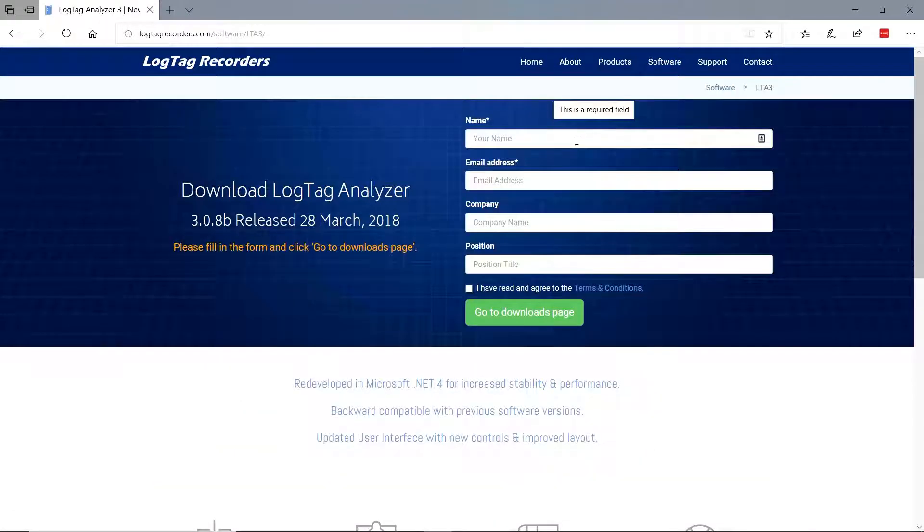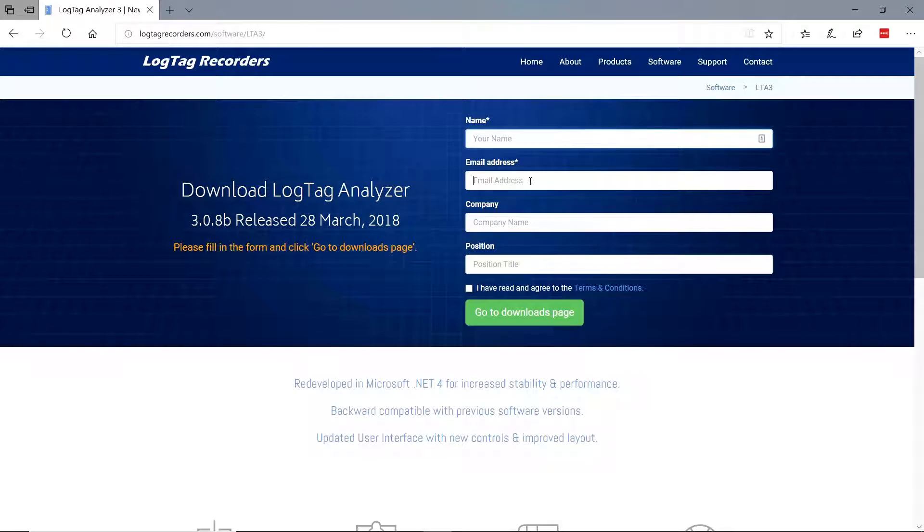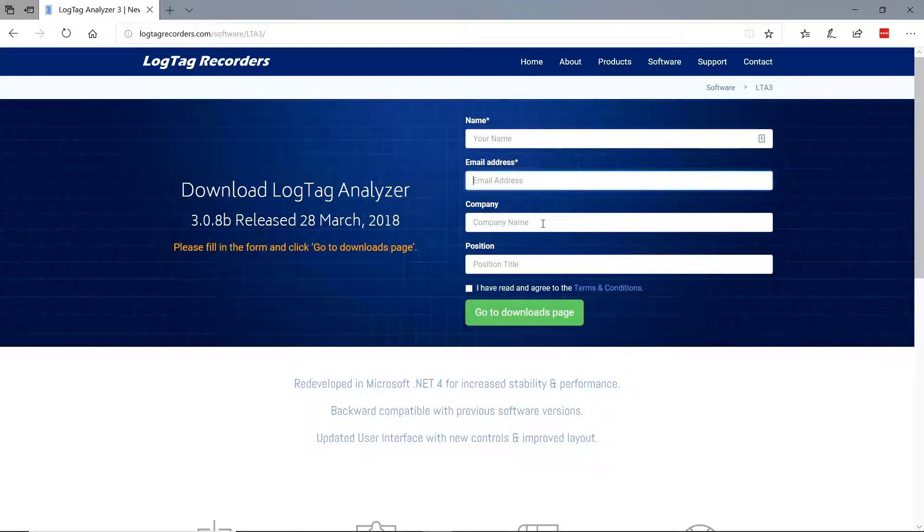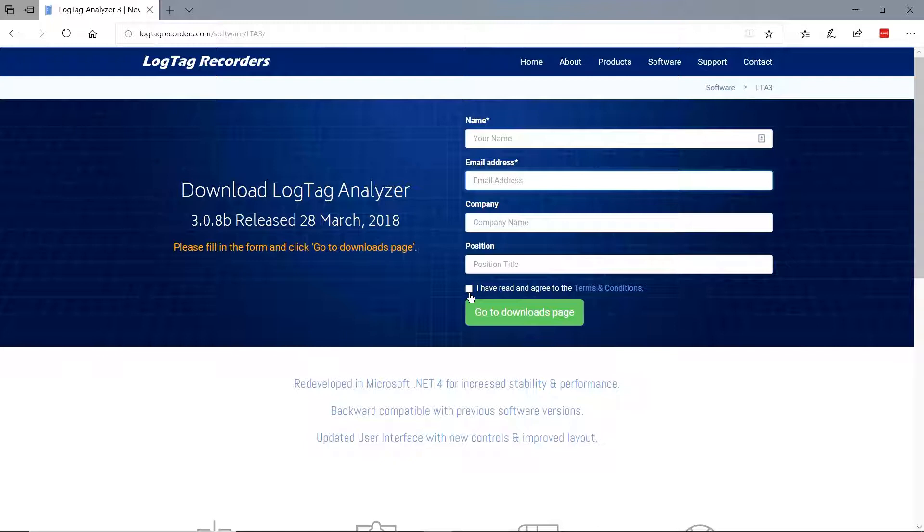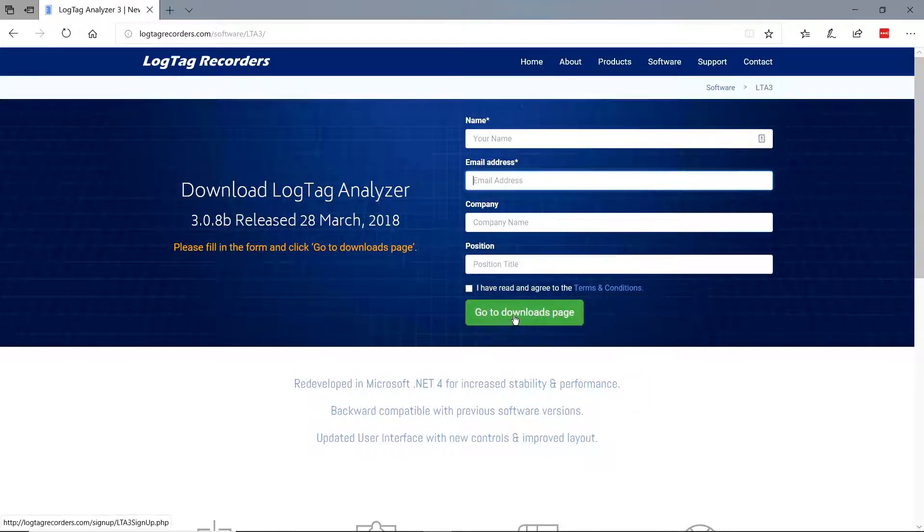Now fill out the form fields with your name, email, address, and if you want, fill the company and position fields. Then tick I have read and agreed to the terms and conditions box and click the button Go to Downloads page.